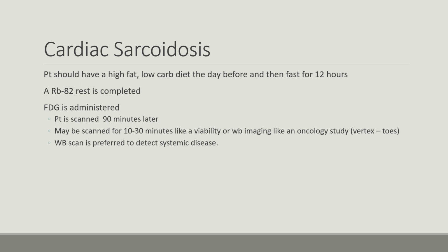Patient is scanned 90 minutes later. Maybe scanned for 10 to 30 minutes like a viability scan, or whole body imaging like oncology where it's vertex to the toes. And the whole body scan is preferred if it is a suspected systemic disease.